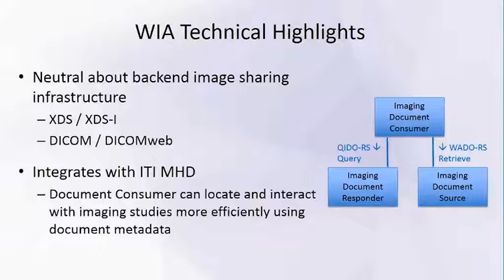And also, as I mentioned earlier, it has integration with the ITI domain MHD profile, the Mobile Access to Health Document. So when the MHD document consumer finds some clinical document that refers to an imaging document, some of the metadata can be used directly within WIA for more efficient interaction with the imaging documents. I'll talk about that in more detail in a second.